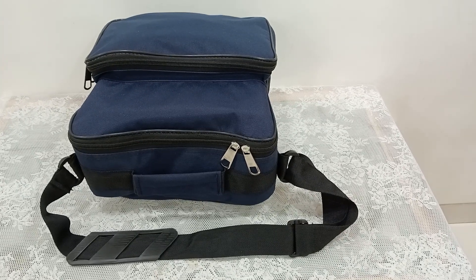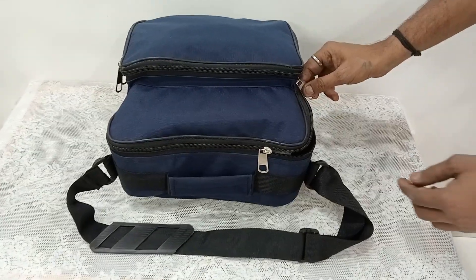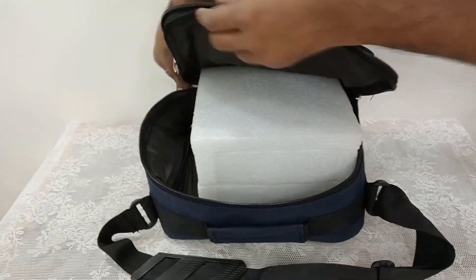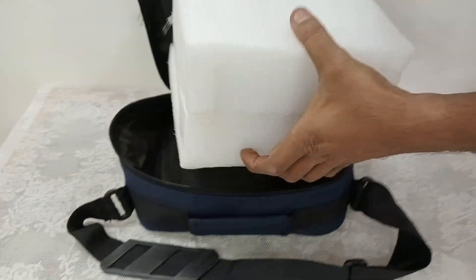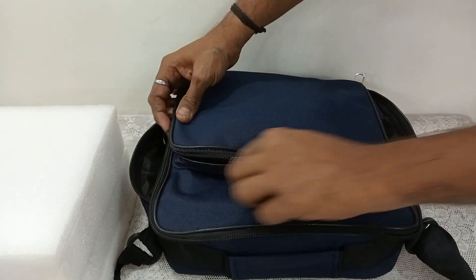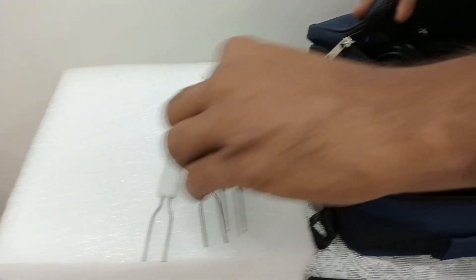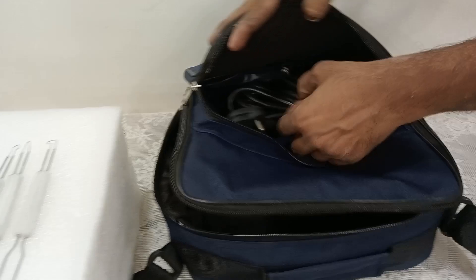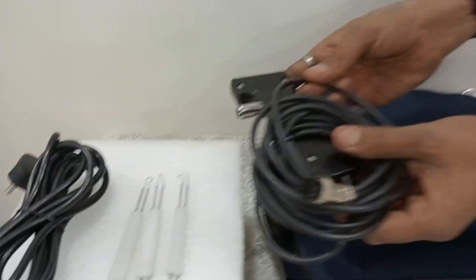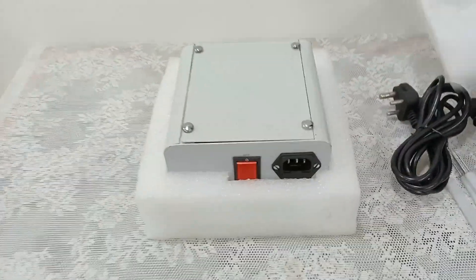Here we are going to see the demo of cervical cautery, which can also be called thermal cautery or heat cautery. Here is the main machine which is in the Heflon box. Here are the accessories which have been used with the machine — you will get 3 electrodes, the mains cord, and the probe. This can also be called a pistol handle.